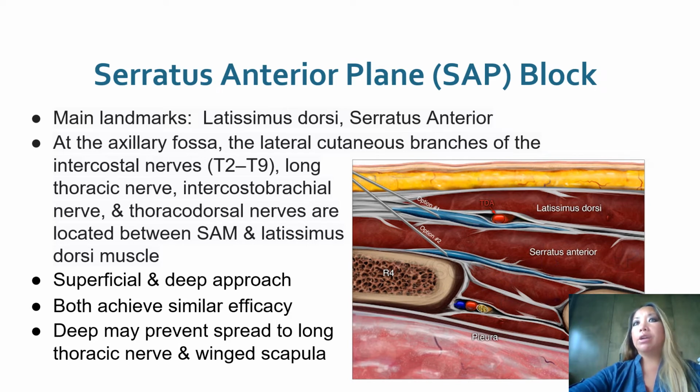You'll have to take care to avoid the thoracodorsal artery, which also runs along that plane, so as to avoid an inadvertent intravascular injection. Some say that going deep may be technically more challenging, but you may be able to avoid a winged scapula in your patient.